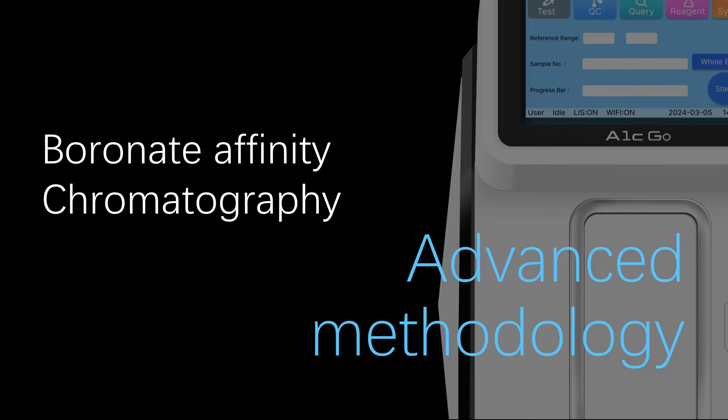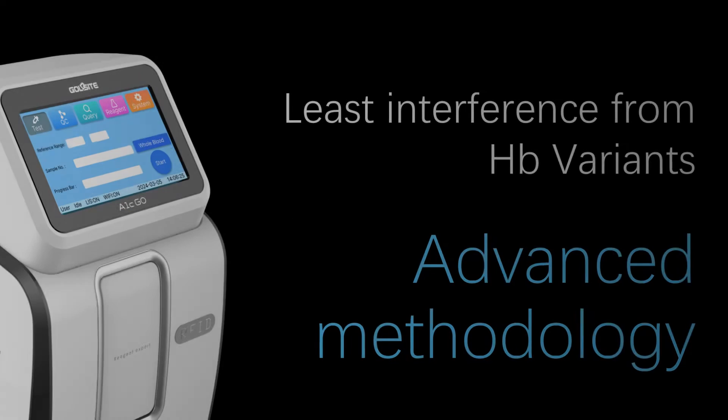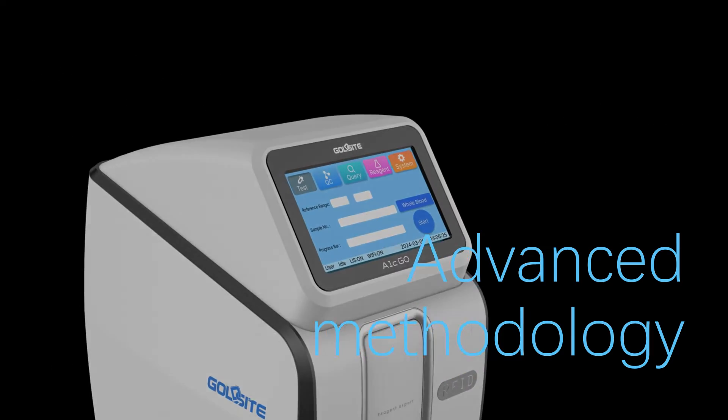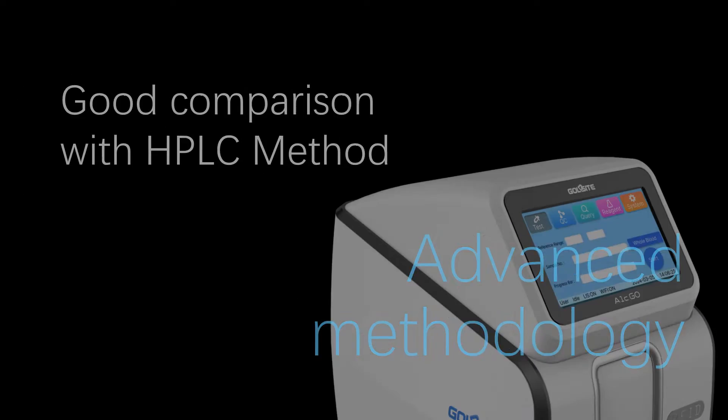It adopts advanced methodology — boronate affinity chromatography — with the least interference from Hb variants. It demonstrates good comparison with the HPLC method.